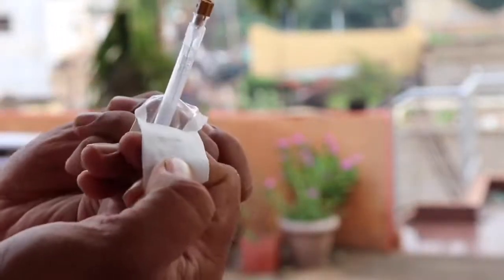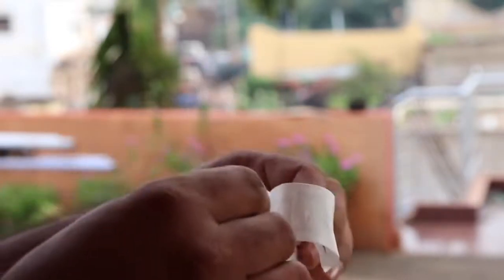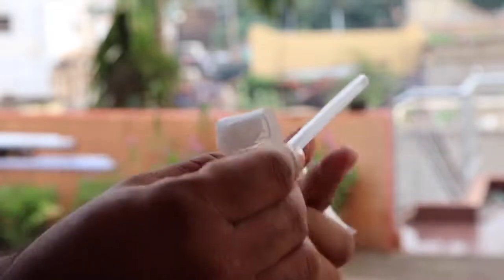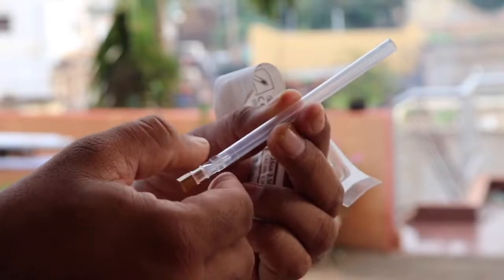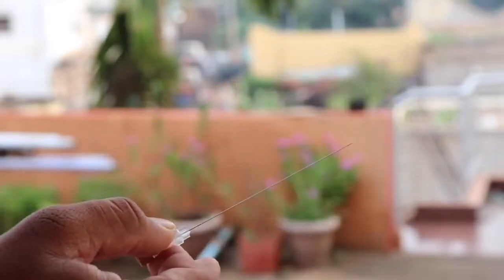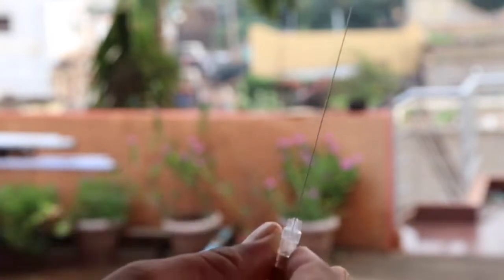You can see the sheath over the needle. Inside the sheath is the needle, and inside the needle there is a stilet. The stilet is much thinner than the needle. I will remove it and show you.